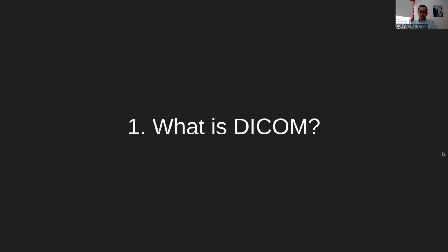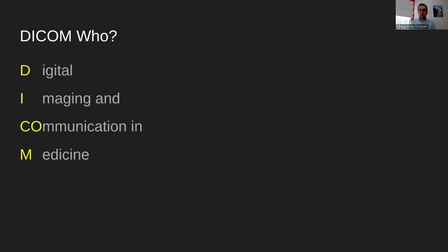So without further ado, what is DICOM? Hopefully, if you've arrived at this video, you have a little bit of an idea, but in case you don't, we'll cover some basics here. So DICOM is Digital Imaging and Communication in Medicine. And it's very important to focus on every word in that acronym: imaging, communication, in medicine. And the communication part is very important. So what does it actually mean?